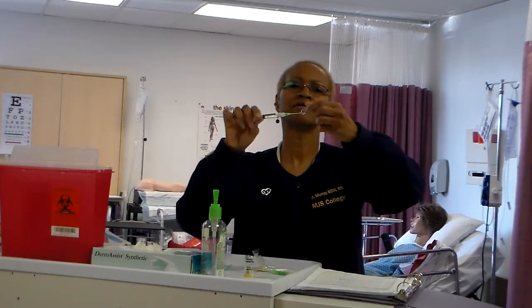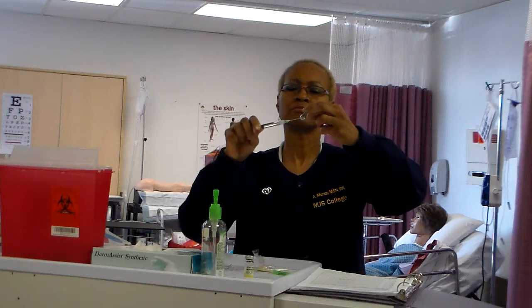Keep your needle down below the level of your medication. If you need to tilt it to the side to get the rest of your medication out, you can do that. Here we go. Now all of your medication is out.